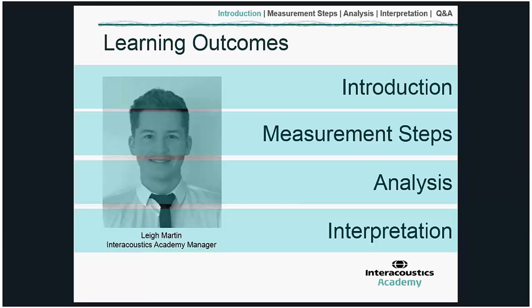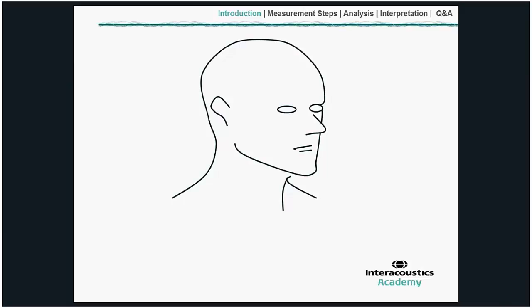If we break the idea of the vestibular evoked myogenic potential down into its individual components, then the name is actually very self-explanatory, and we can get a lot of information from it. If we start with the V in VEMP, vestibular, this means, of course, that it's arising from the vestibular system, and we'll learn a little bit later that the main organ it's arising from is the saccule. Of course, there are two types of VEMP, and if we record from the eye, which is the ocular VEMP, then we're looking at the utricle.